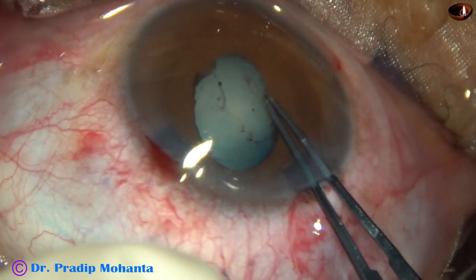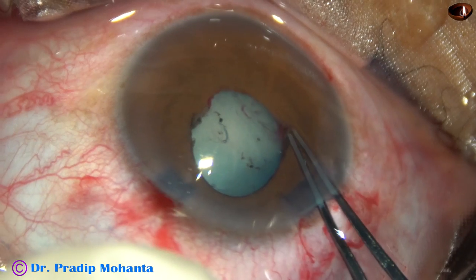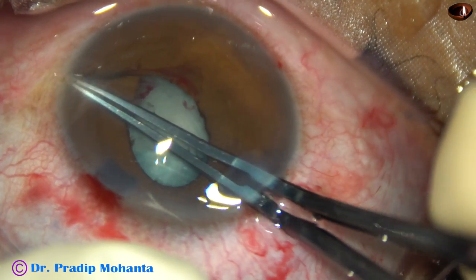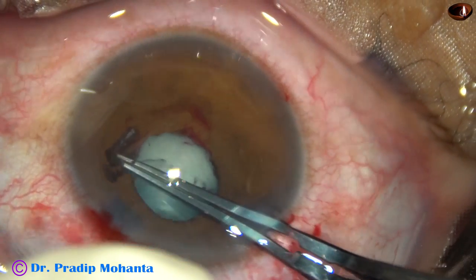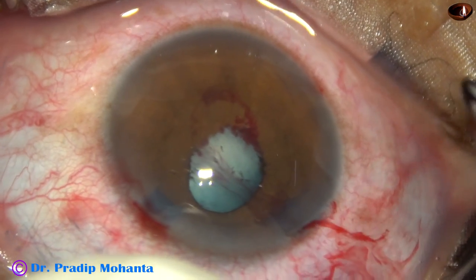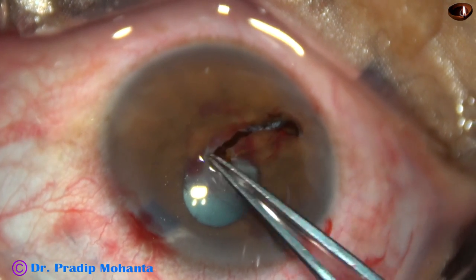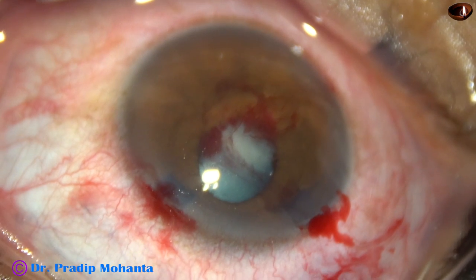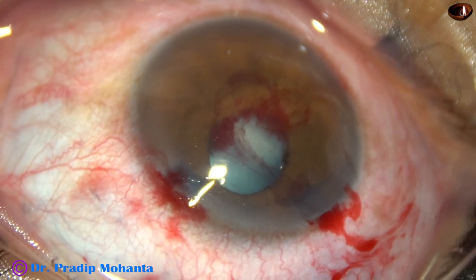In all your maneuvers during surgery, you will not always be successful, but we have to keep trying. So here from 10 o'clock I have been able to hold the fibrous band and separating it, detaching it from the iris, and have removed it. See how thick it is — it was holding the iris, holding the pupillary margin.